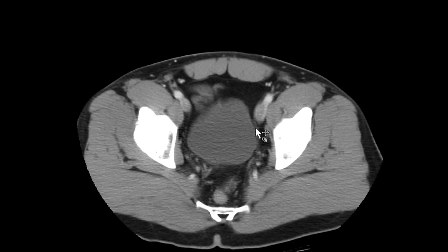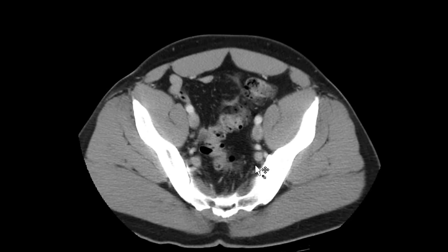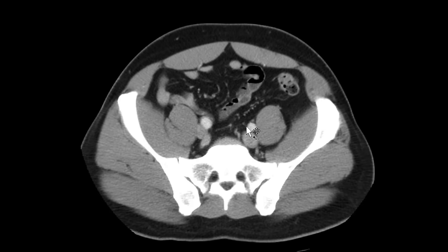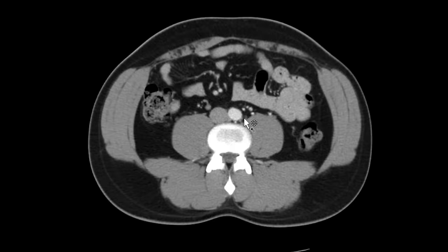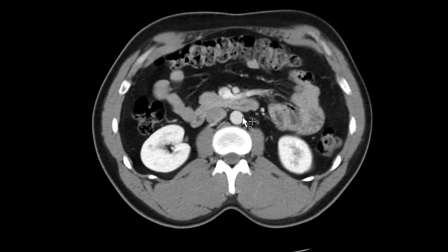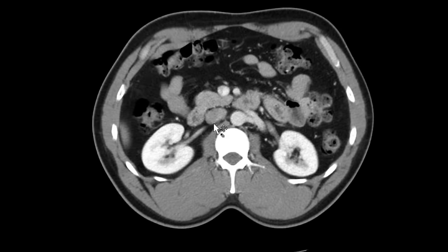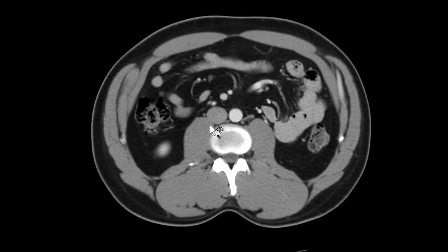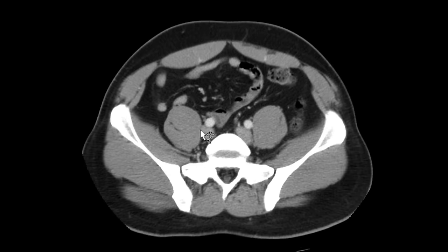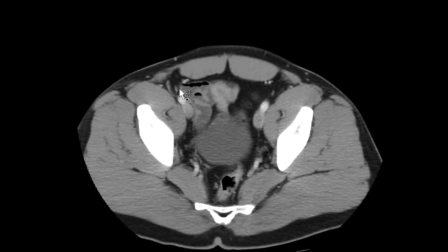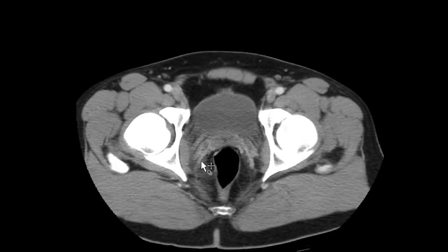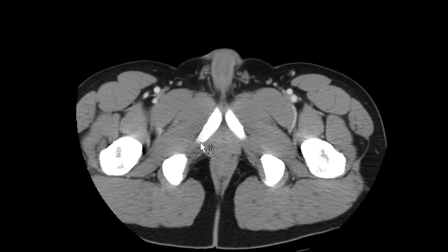I look for lymph nodes along the course of these vessels — you'll see them along the pelvic sidewall and along the retroperitoneum. I scan back and forth a few times to look for all the lymph nodes around these regions.